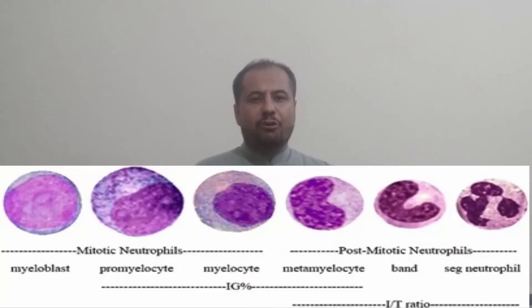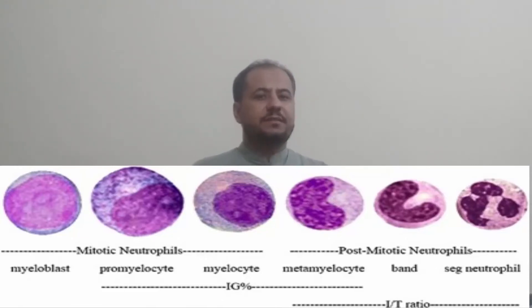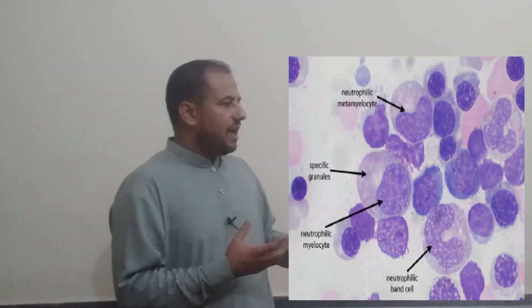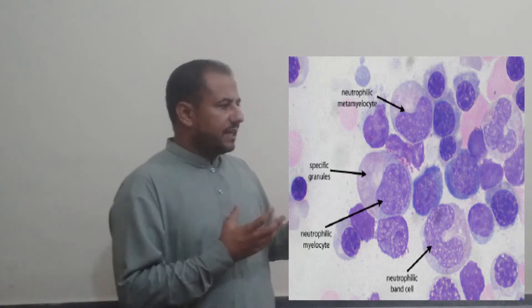In leucocyte, we will mainly focus on granulocyte. In granulocyte, we will focus on promyelocyte, myelocyte, metamyelocyte, band cells, and mature neutrophils. As we can see in this picture, this is a complete picture of the granulocyte series — myelocyte, metamyelocyte, and band cells. This slide shows us only the granulocyte series.